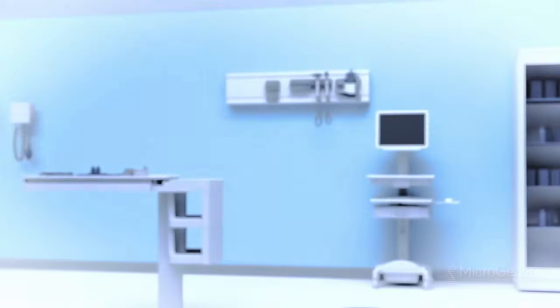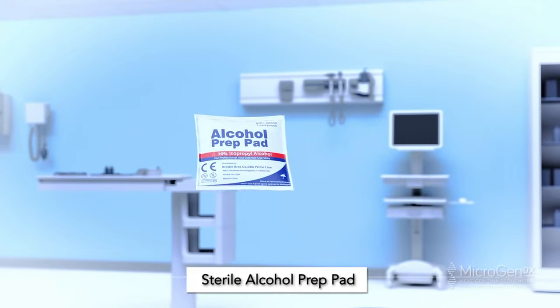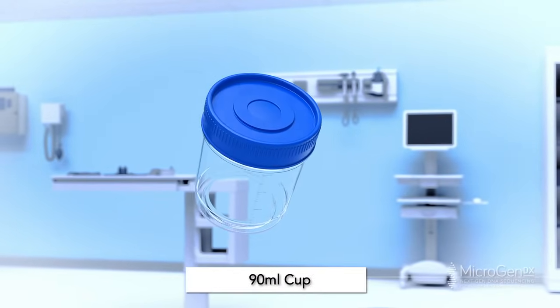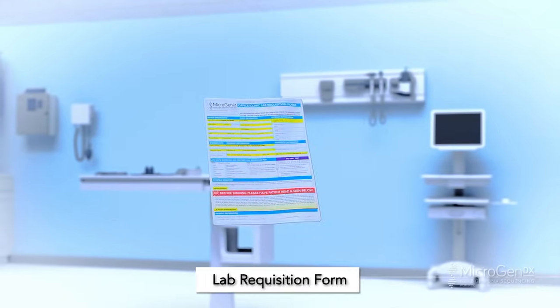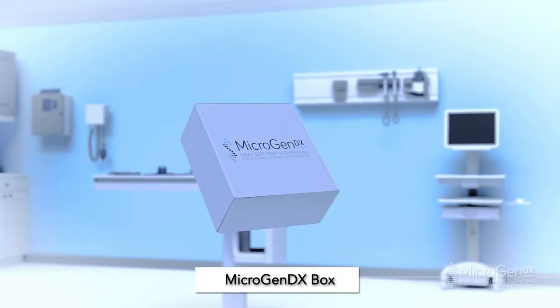The MicroGen DX Collection Kit will include 1 sterile alcohol prep pad, 1 90ml cup, 1 multipurpose swab, a bio bag, a lab requisition, and a MicroGen DX box.